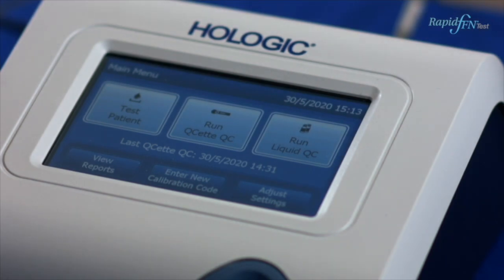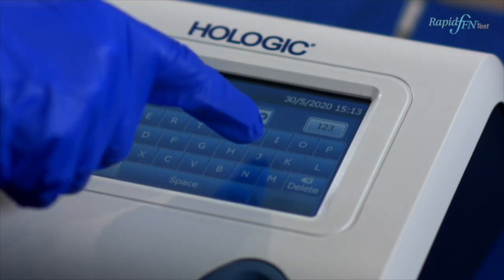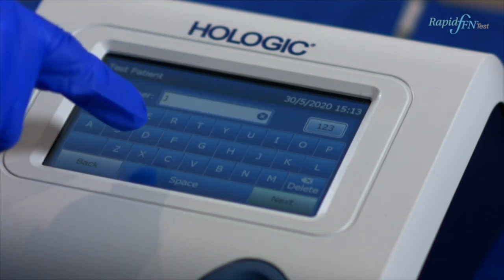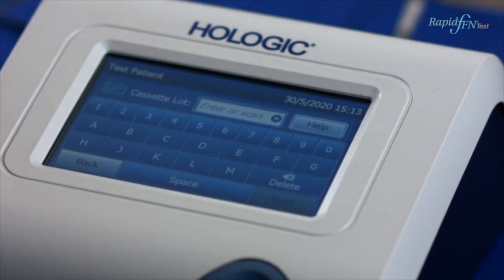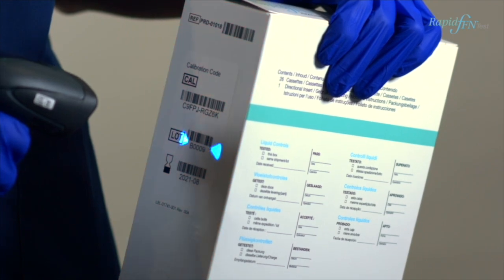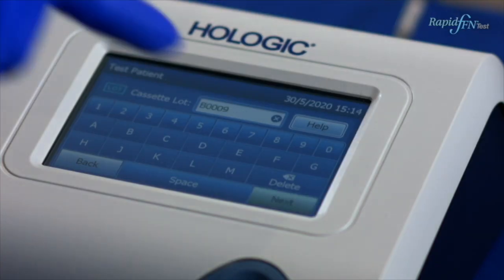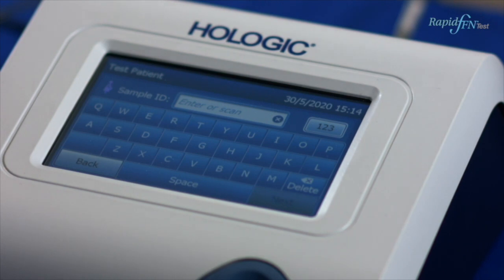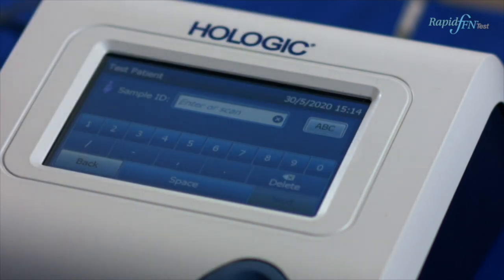Select Test Patient. Enter user ID either on the screen or using the barcode scanner, then press Next. Enter lot number either using the touch screen or the barcode scanner and press Next. Please note, if the cassette lot number has changed, you must set calibration.